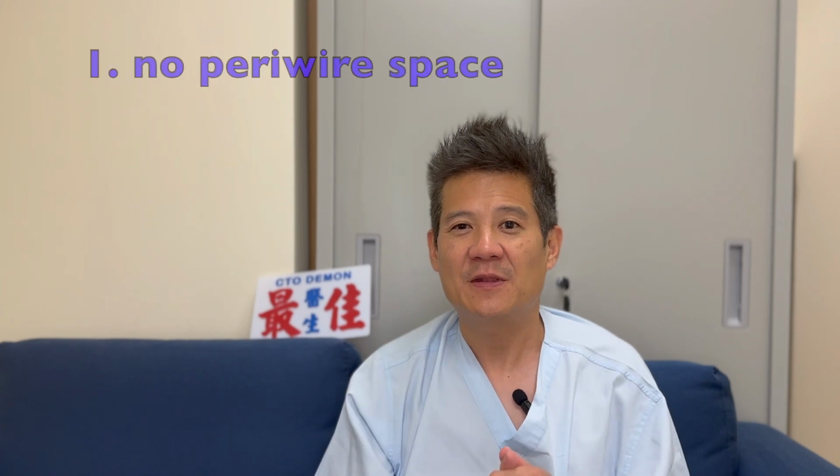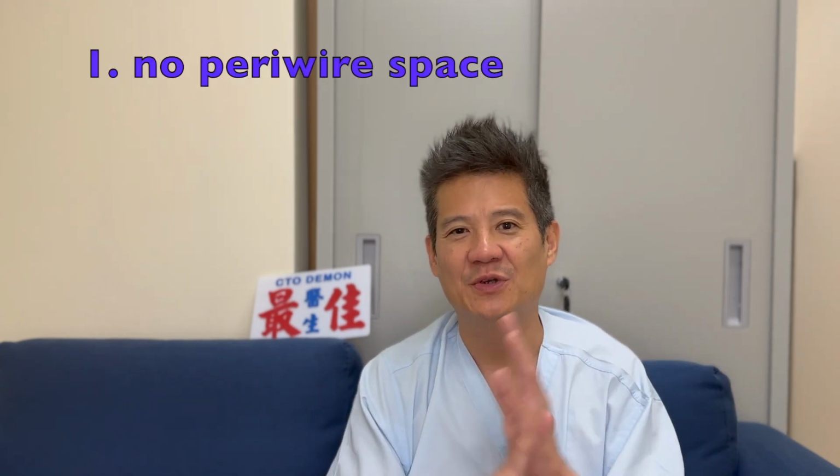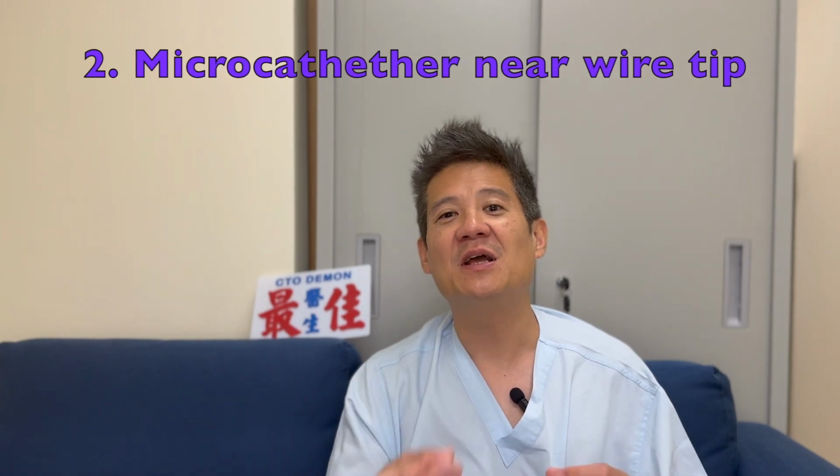But there are certain conditions needed for us to wire towards the end of the balloon. Number one, there mustn't be too much wiring previously in that territory. Because if there's a lot of peri-wire space and we don't have retrograde wire control, it's not going to work. Secondly, the microcatheter must be able to get near to the retrograde wire tip because you want to be able to control the retrograde wire. If your microcatheter is stuck in the ostium of the PD and your CTO is in the mid-RCA, then with a lot of bare wire, you can't control that wire. Then wiring towards the end of the balloon is going to be difficult.